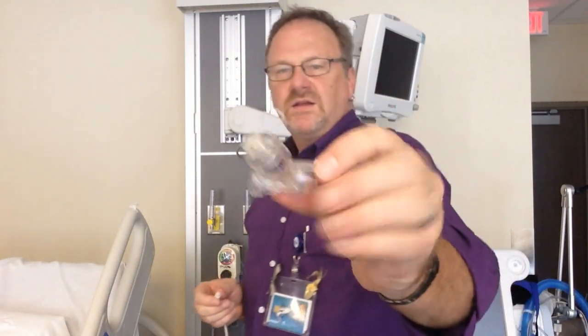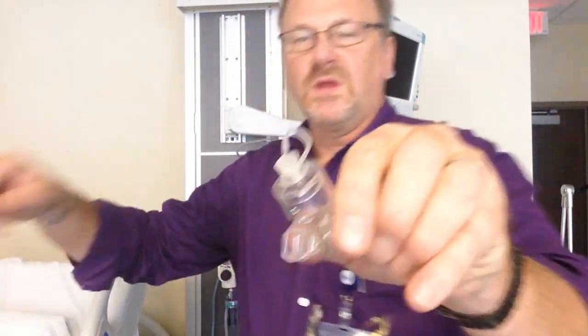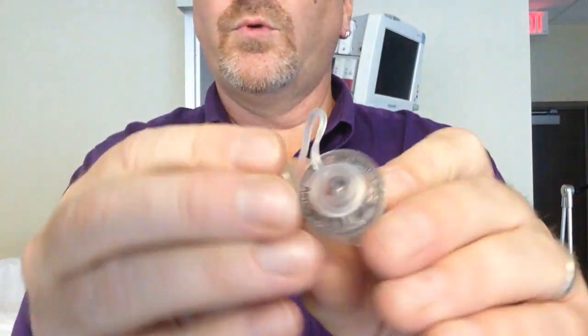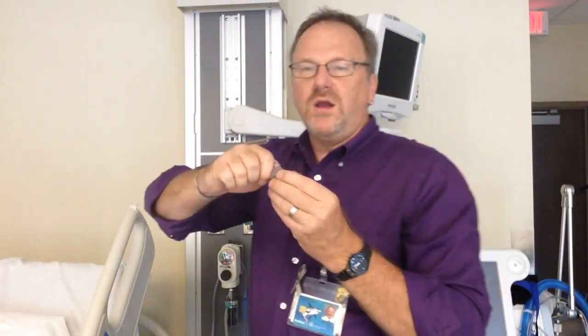This is the Aerogen Solo. This is where the medication goes. If you look on the end here, you can see little threads. Those threads are where we can actually screw on a continuous feed — it'll be hooked up to a feed pump, and it drips medication drop by drop. So if we have someone on a continuous nebulizer, we can deliver medication for hours on end.